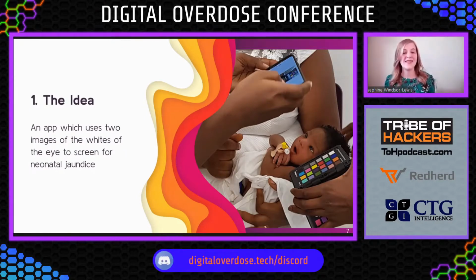We need to get rid of this effect altogether. And we do that using subtraction methodology. So we take a picture with flash on, a picture with flash off, and we subtract the values of one from the other. So what we're left with is a composite image made only of the light that is collected from the flash itself. The ambient light, therefore, has no impact. It's just the flash, which we know because we can control for that. We know exactly what the flash is on all the different phones, the color, the temperature, all of those things.